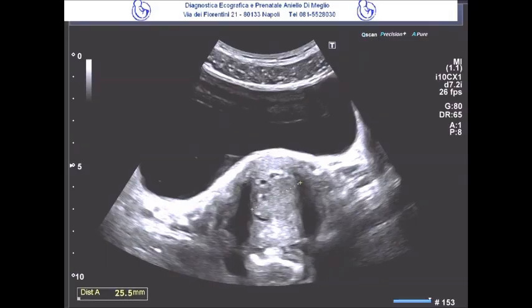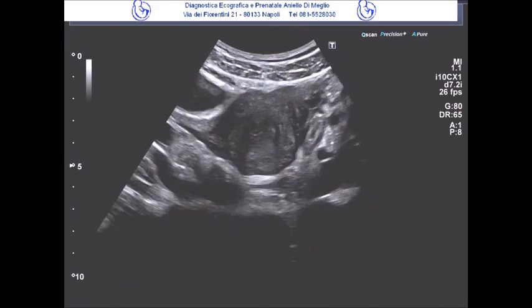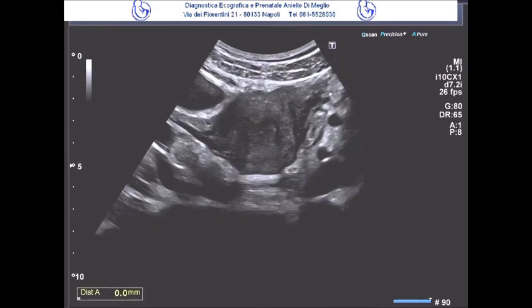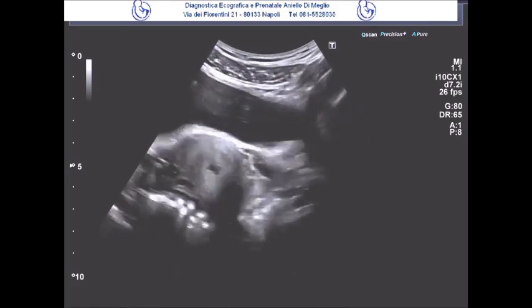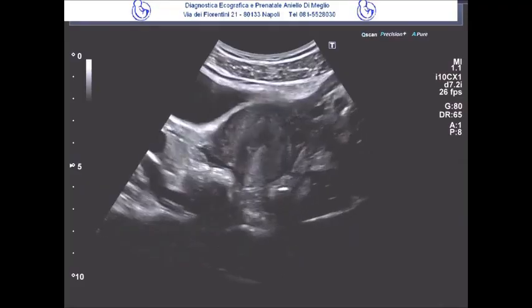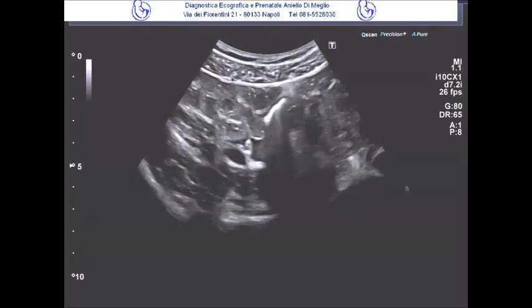Now that the detailed uterine assessment is complete, the evaluation proceeds to the next phase, a transabdominal study designed to visualize the ovaries. This approach gives us a clear and comprehensive view of the adnexal regions. Upon careful inspection of both ovaries, the findings are reassuring. They appear bilaterally normal, which means that we are not detecting any significant structural abnormalities on either side.